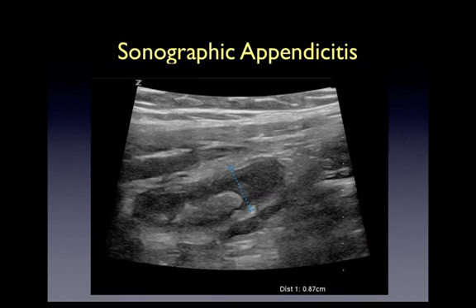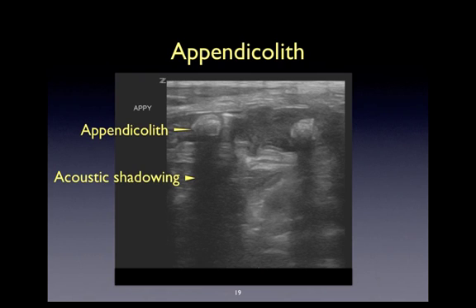This is another example of appendicitis where the sonographer is measuring in long orientation. You can clearly see the blind-ended structure and a very thick appendicolith within the lumen of the appendix. In this very interesting and rare occurrence, there is the presence of two appendicoliths. Both of them demonstrate the classic features of a very bright, echogenic appearance sonographically, and the appearance of posterior acoustic shadowing.